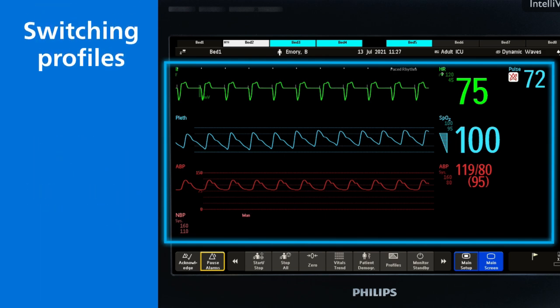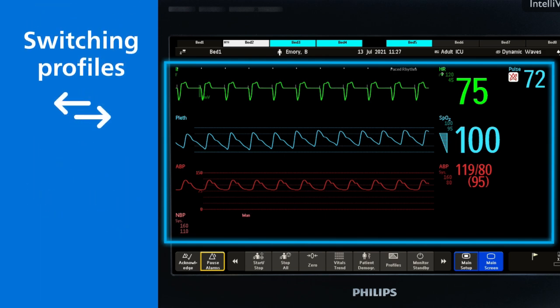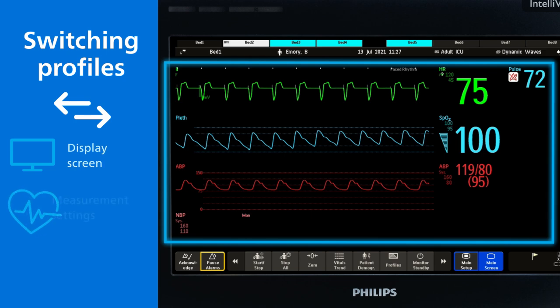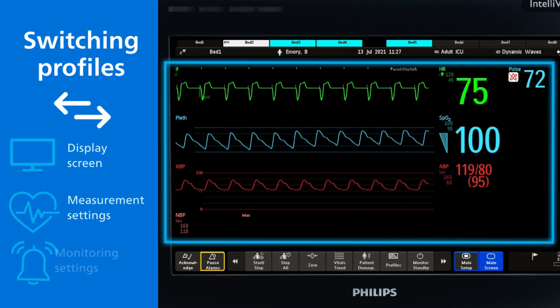Switching to a different profile may include changing the display screen or the measurement settings, such as alarm limits or NBP interval, as well as changing monitoring settings, such as alarm behaviour, wave speed or tone.